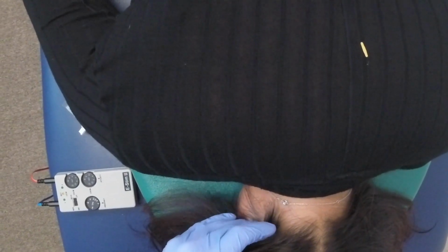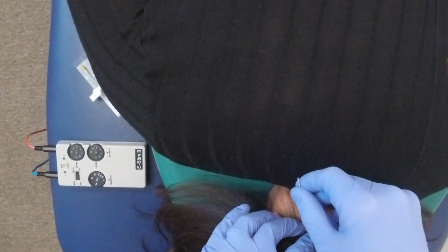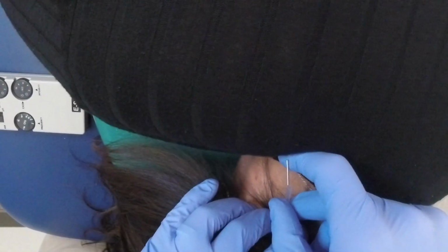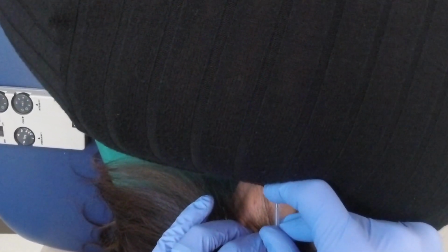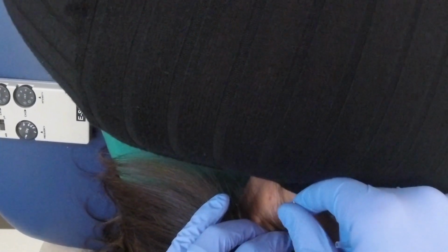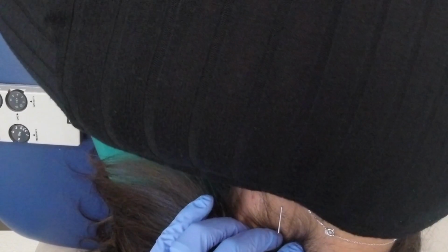So we clean off the skin with alcohol and we feel for our landmarks. We feel for areas of the muscle that feel sore or tight and achy. Trigger points are parts of muscle that are really inflamed, and so a lot of times as we're palpating, we'll feel those spots as we run our hands over those areas. It will feel different than other areas of the muscle that aren't having issues.